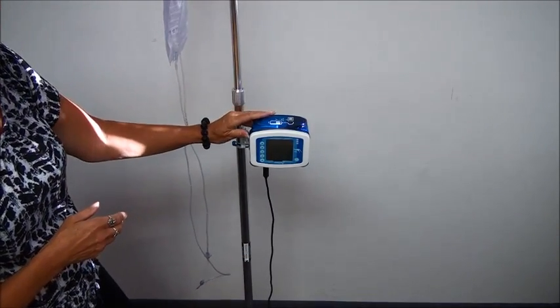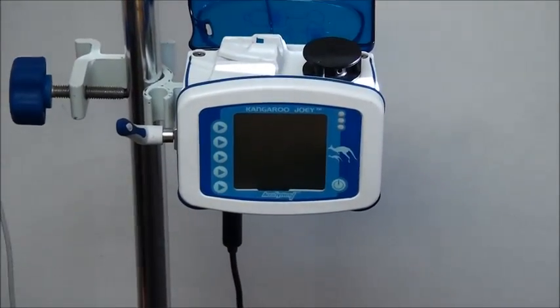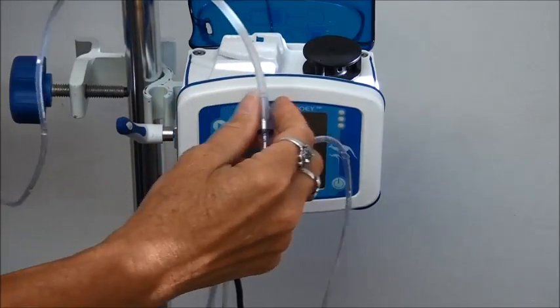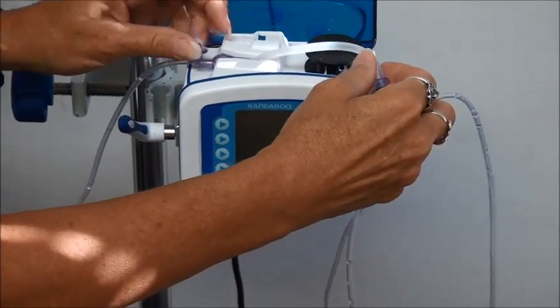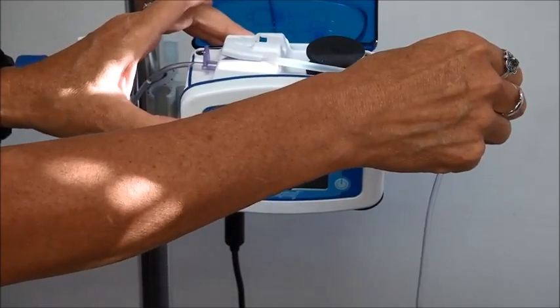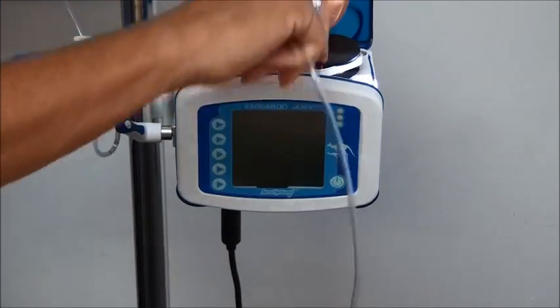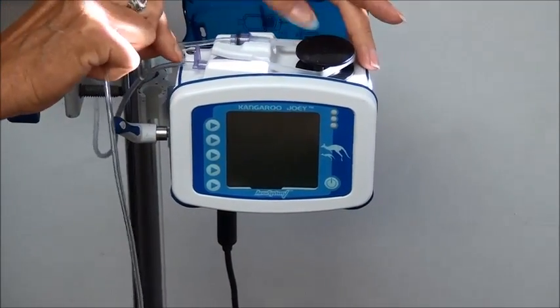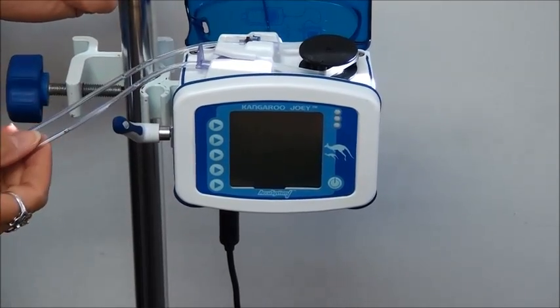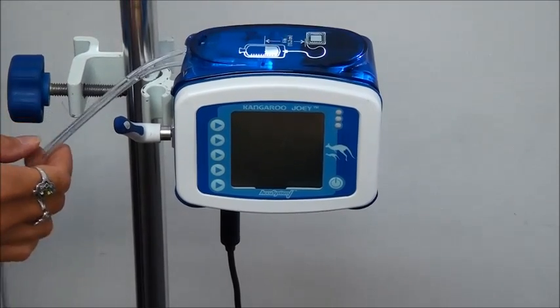There's a blue door on the top of the pump. You are going to want to open that up, and then you're going to install your tubing for your pump set. You're going to grasp the thumb control and snap that right into place. There's a stretchy part to the tubing and you're going to stretch that around the wheel, being careful not to overstretch. And then you're going to snap the other end of your tubing set into place. Your tubes are going to come out the side of the pump and you're going to close the door.